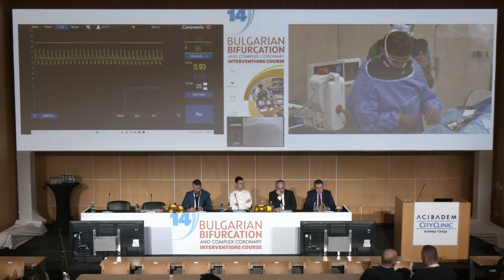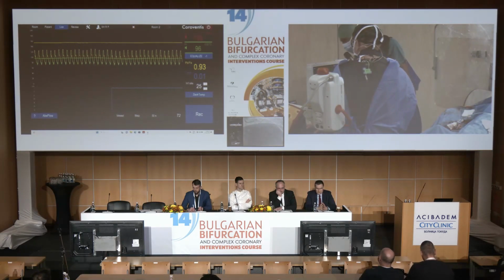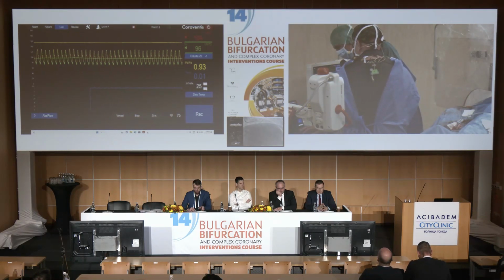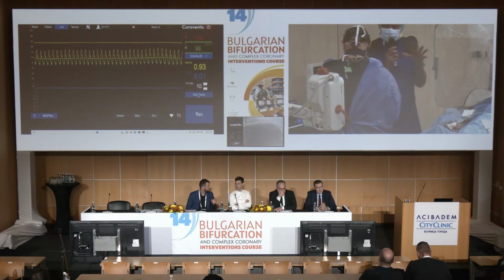Yeah, I think it is well fixed. No, it is well fixed. That is not that important. Okay. You're right. Okay, Valérie is observing that we have to program everything to have the right flow rate. But let's go step by step.